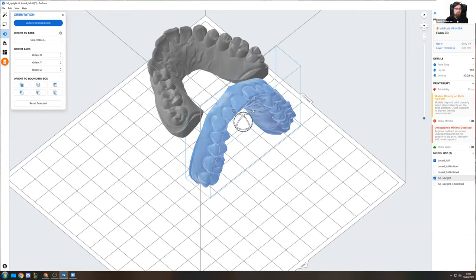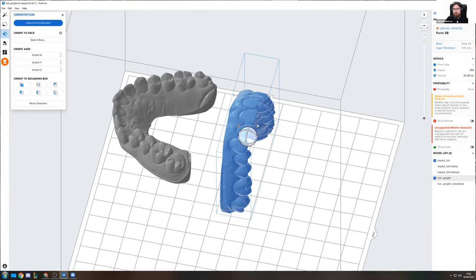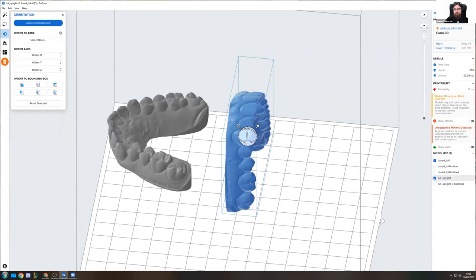This is something where you can also do a mix and match of both of these things, where if you're coming into the lab in the morning, let's say 8 a.m. or so, you're starting a print right then, and you want to have something finished about lunchtime, you would just be putting your models flat on the build platform itself. And then if you have a little bit more time, let's say you're ending your day at like 4, 5, 6 p.m.-ish, then you don't really care if your print is done at 8 p.m. in the evening or if it's done 1 a.m. the next morning. If you're in the next morning at 7 or 8 a.m. again, you don't care if the printer has been standing for 6 hours or for 2 hours. But what you do care about is whether or not you have 7 models or 25 models. Well, that's quite a bit much, let's say around 16 or so maybe done on the build platform. So this is also something where you have a little bit of a choice to yourself. And this is also one of the things that we strive for, to basically leave you to do whichever one you like better.